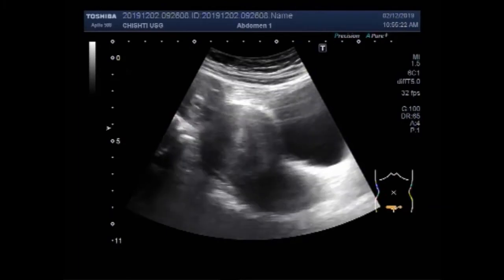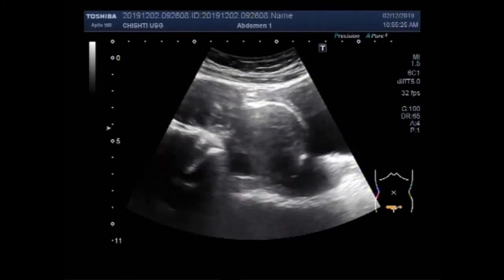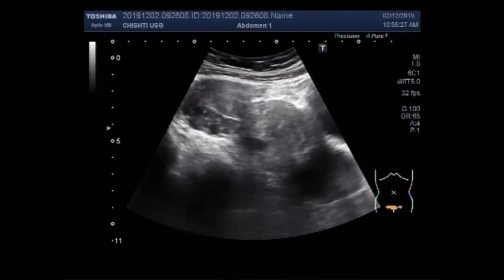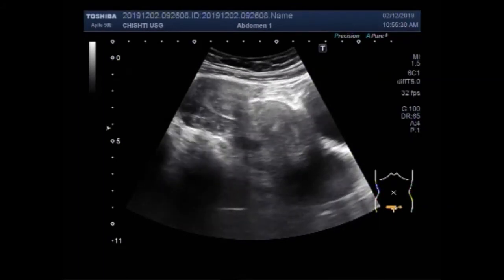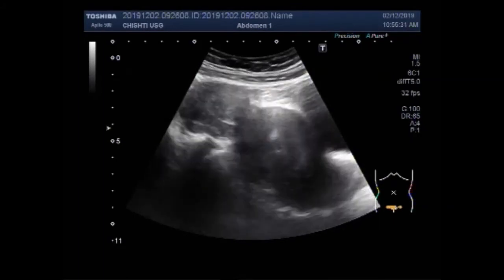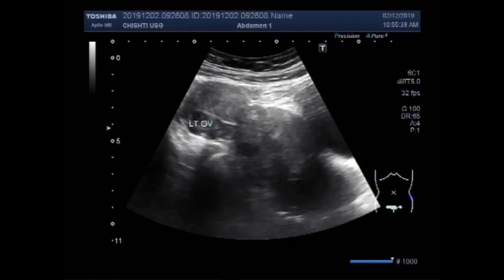Multiple fibroids along with the left ovary mass are visible. You can see the left ovary having a mass. This is the left ovary, and this one is the ovarian mass.